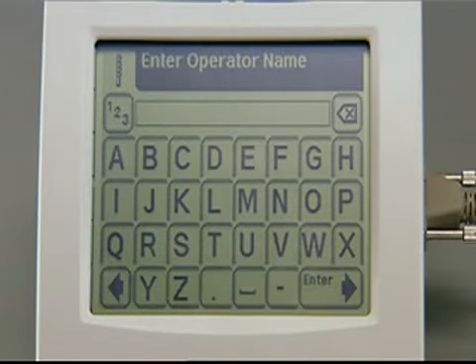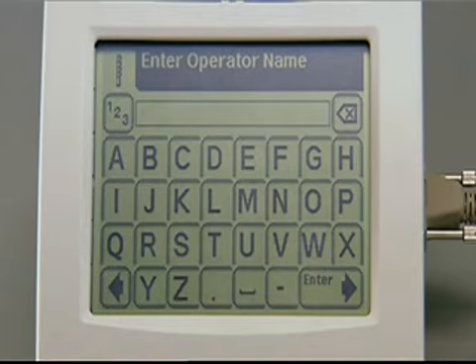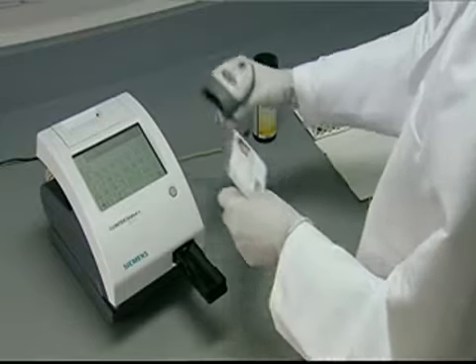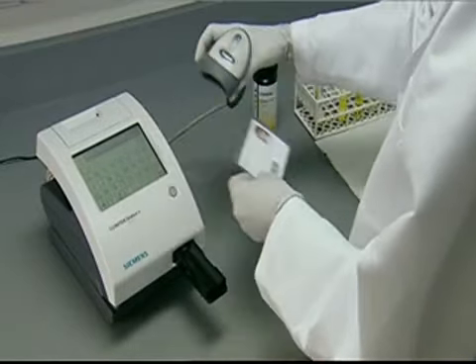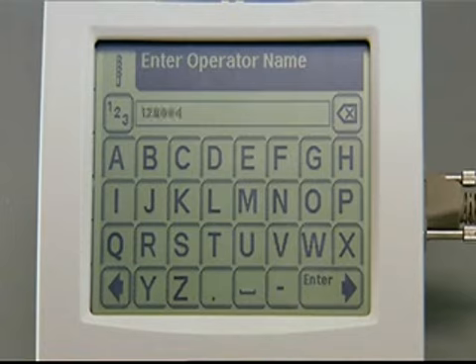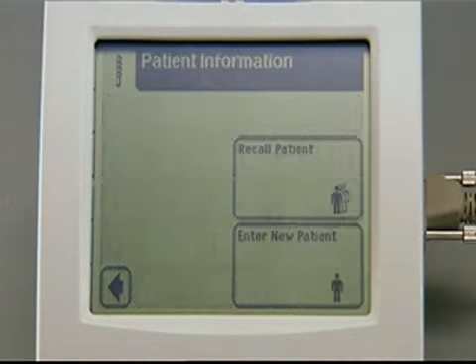On the Enter Operator Name screen, use the keyboard to enter up to 13 characters. If using the Clinitec Status Connect system, an optional barcode reader can be used to enter Operator ID. Touch Enter to accept the change and advance to the next screen.